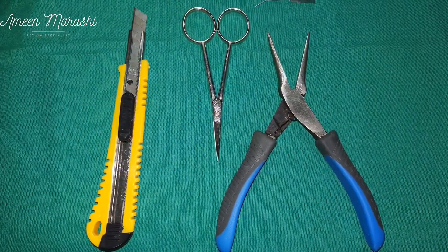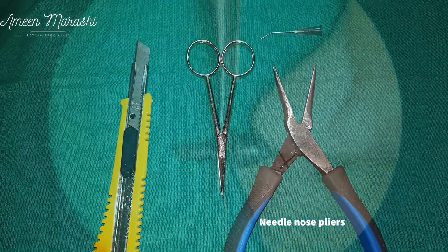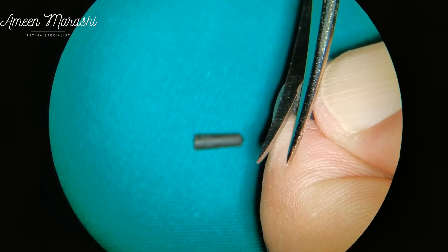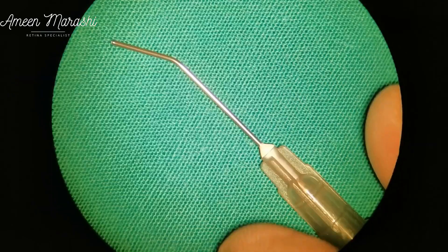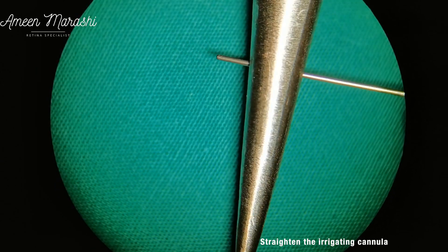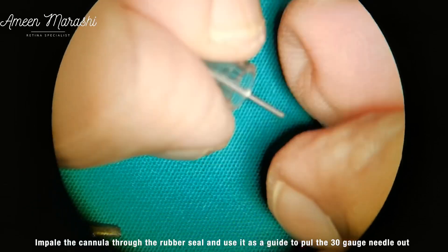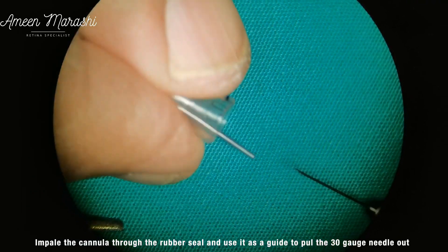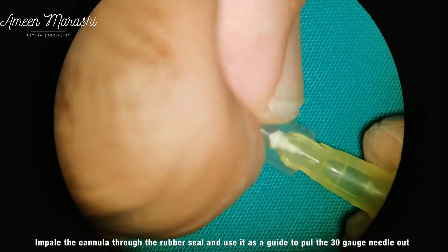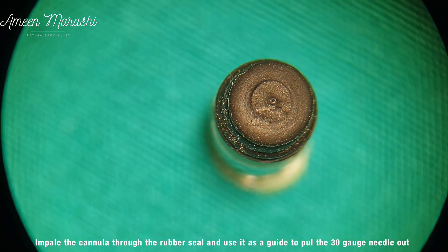Here is another way to prepare the rubber seal, which needs additional instruments such as an irrigating cannula and needle nose pliers. After cutting and preparing the rubber seal and mounting it to the plastic luer slip, the needle nose pliers are used to straighten the irrigating cannula. It is then impaled in the rubber seal through the leading ring, and then the 30 gauge needle is fitted to the cannula and used as a guide to pull the 30 gauge needle out of the rubber seal. Then the plastic luer slip is fixed to the plastic part of the 30 gauge needle. This technique ensures that the leading ring of the rubber seal is smooth.